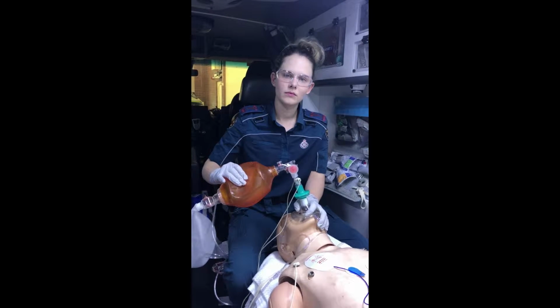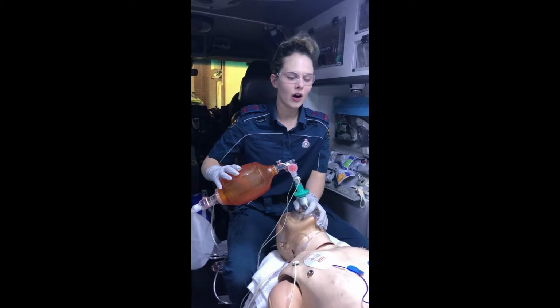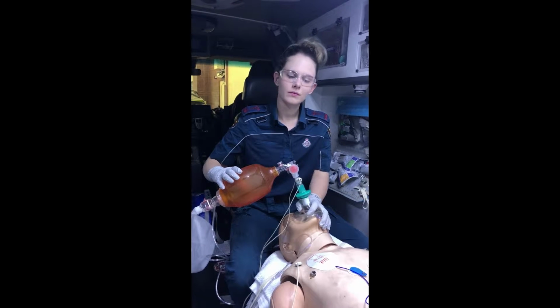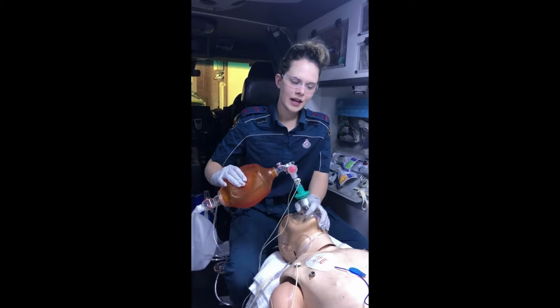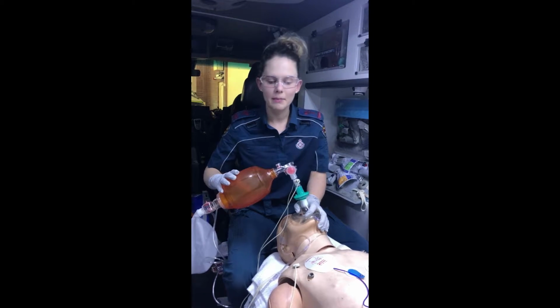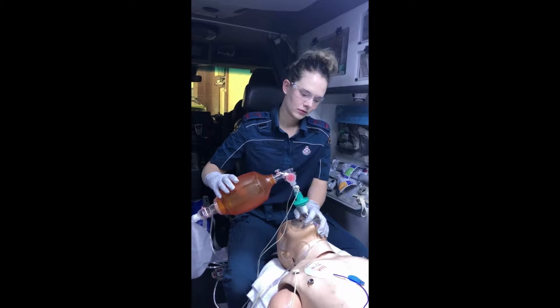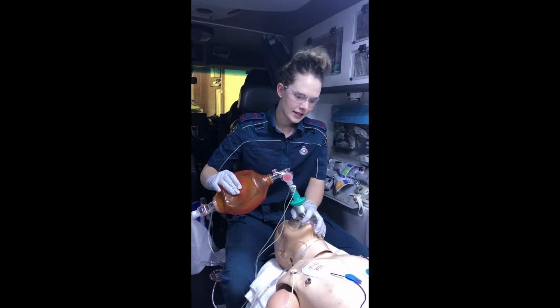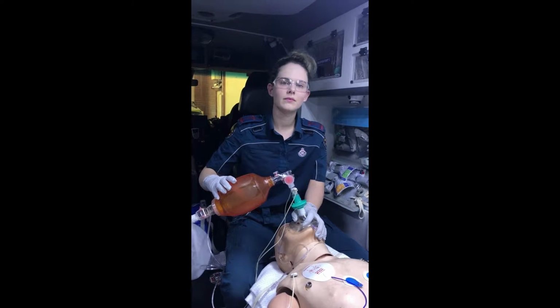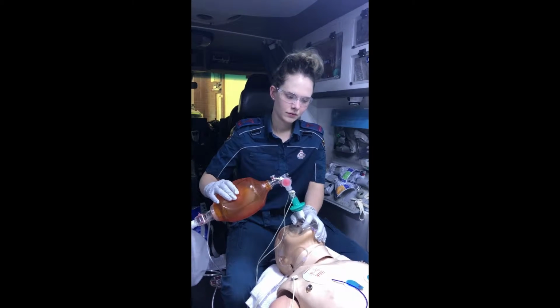Can the patient's hemodynamic status be optimised? It has been optimised with IV lines and a pre-hydration of 10 ml per kilo. Has comprehensive patient monitoring been applied and working? It has been applied. The temperature and blood sugar were within normal limits. The blood pressure has been set to 3-minute cycles. Is there patient IV access with fluid connected? There is. There's two 18-gauge cannulas in the ACF and it's free-flowing. Is the suction on and working? It has been checked.